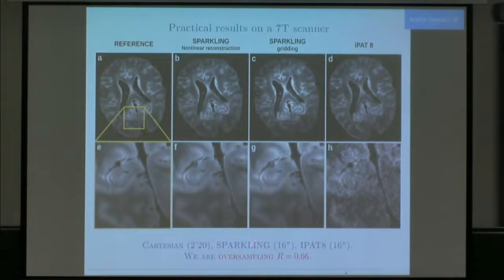We take nearly twice the number of measurements. The reason is that we decreased the sampling period delta t as far as the machine allows. This is something most physicists will never do, because by doing so you decrease the signal-to-noise ratio you get per sample. But by doing this, you actually improve the resolution in your k-space, and it's much harder to get resolution than SNR. It's something that is not known, I think, in MRI, that you should take your sampling time as small as possible to gain in resolution in the Fourier domain.